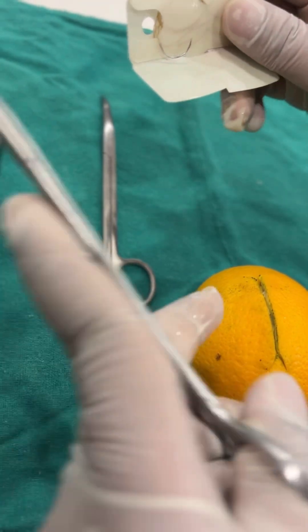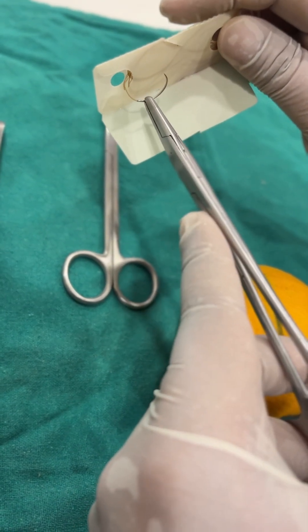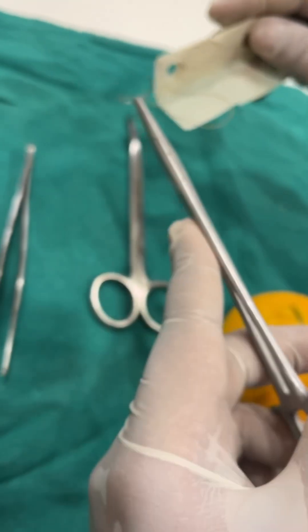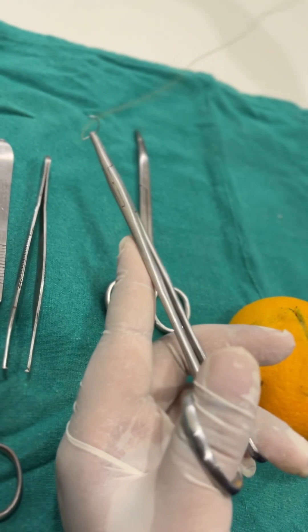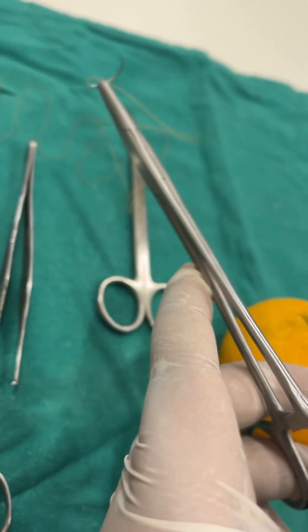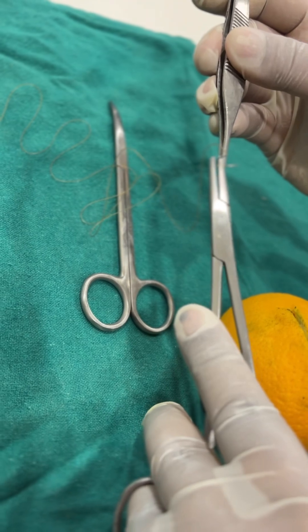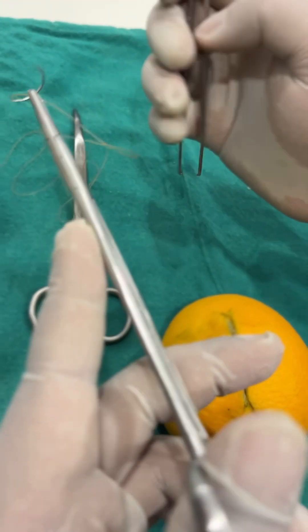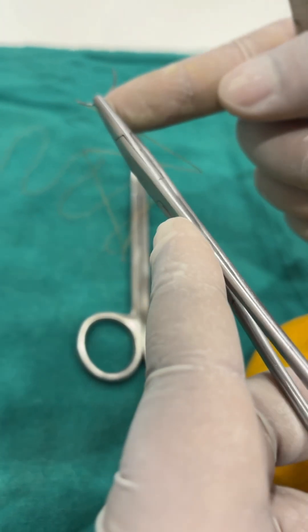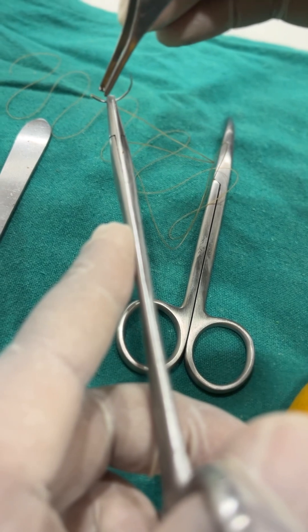Now we carefully engage the needle. A common mistake people make is instead of moving the wrapper away, they move the suture. You have to move the wrapper away from you and not the needle. Now we will orient the needle. When loading the needle it should be two thirds from the tip, or you can keep it in the middle as well. But never hold the needle at the junction of the thread and the needle.